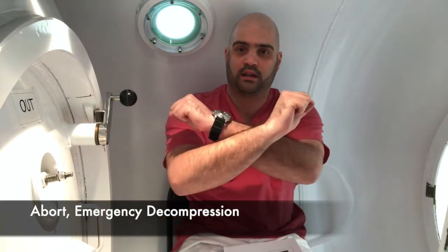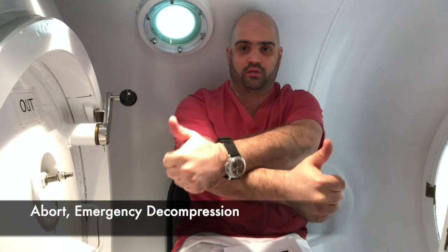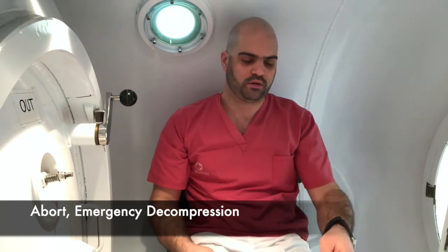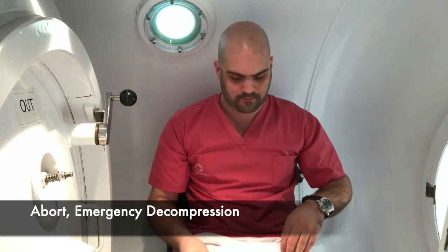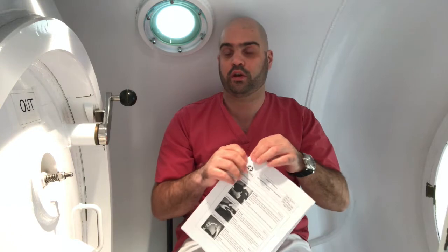We have this signal that means abort the compression. It also can be used with 2 thumbs up and crossing the arms like this. This means that you have an emergency situation and you need to abort the compression in an emergency procedure. That means a fast decompression to the surface.